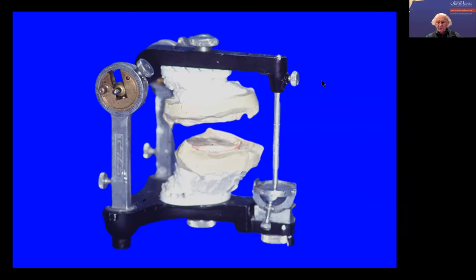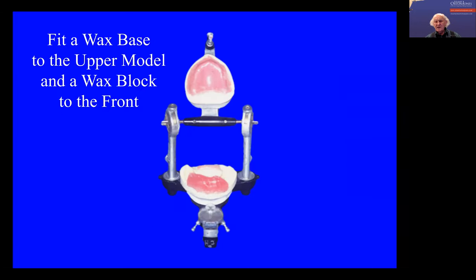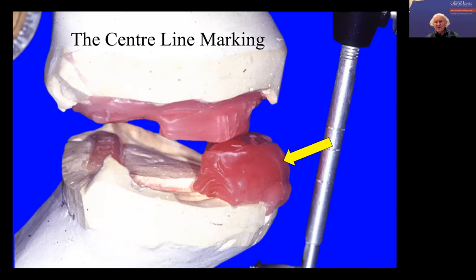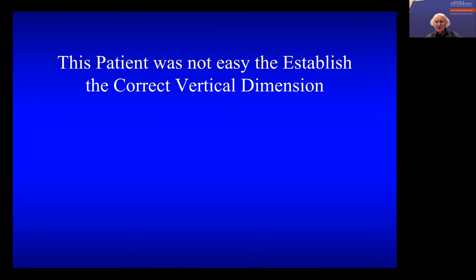So now we've got the models mounted and they are at the right vertical dimension, as far as we can tell. When we come to check the wax-up stage, we may find it's not correct. So you then Vaseline the upper and put some wax on there and mount the upper front teeth. The articulator has been opened about two to three millimeters to allow for the shrinkage of the wax, and so you mount the upper dentures.